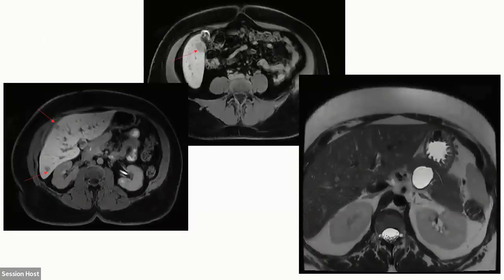Oh, here's her MRI. Great. So I threw that in there too, so that you can see some of these little liver lesions there. I honestly had not much concern that this was a malignancy, but rather was a constellation of symptoms.